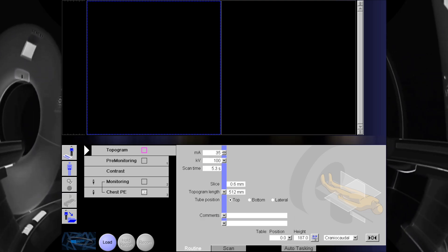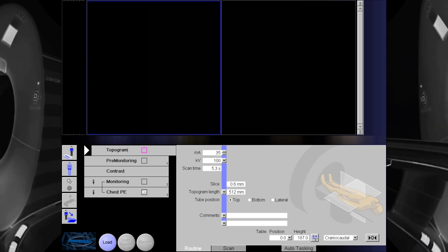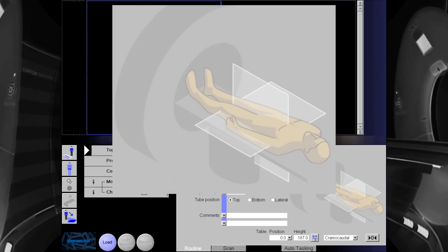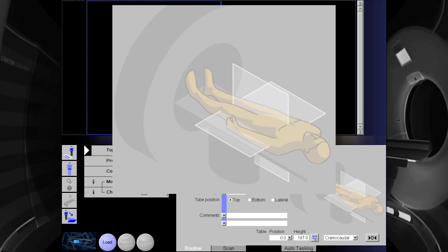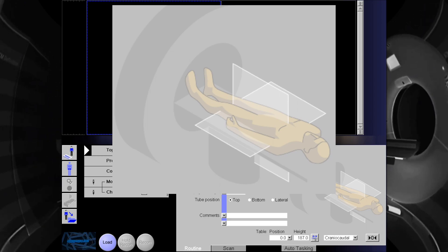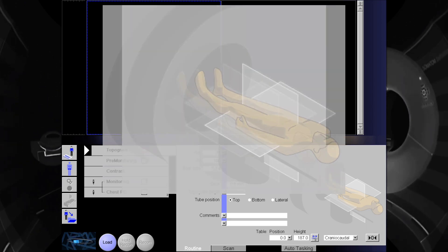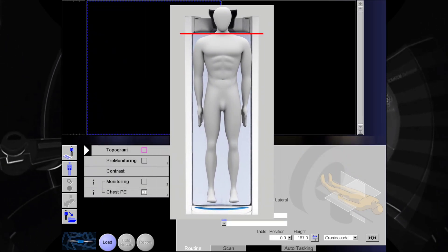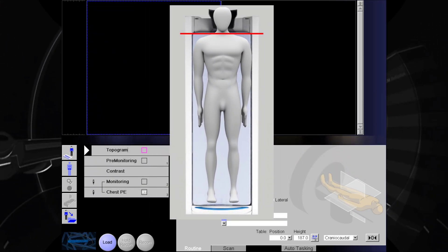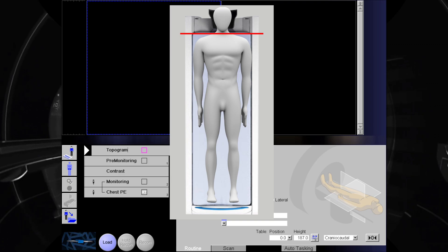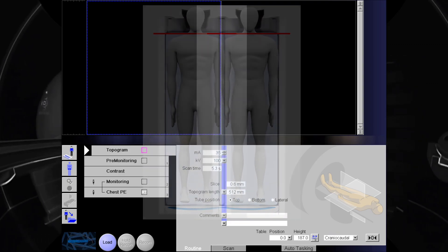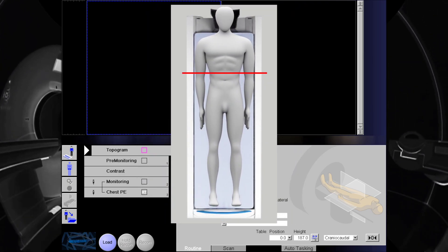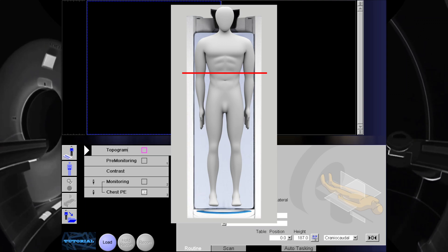Let's start with our patient position. Our patient position will be supine, feet first, and arms raised above the head. Place beam light in lower neck if you want to start scan cranially, or in upper abdomen if you want it caudally.